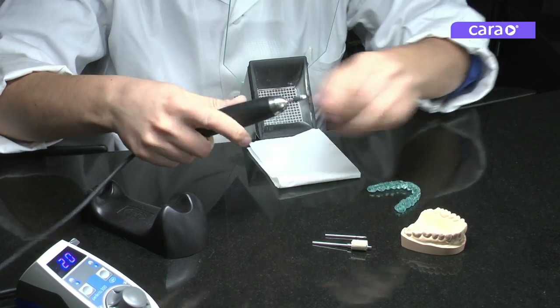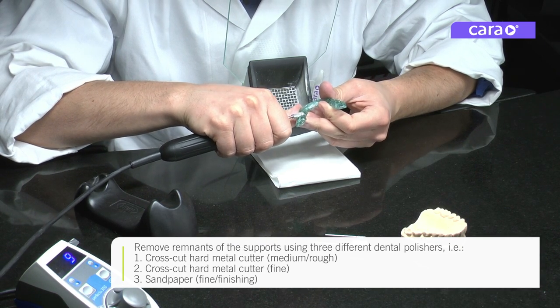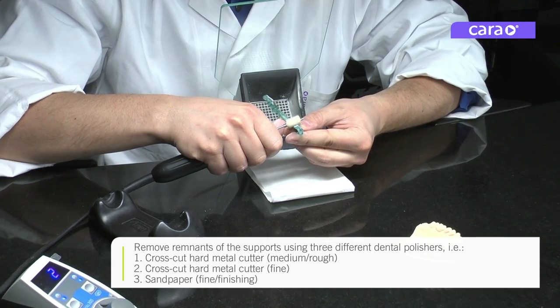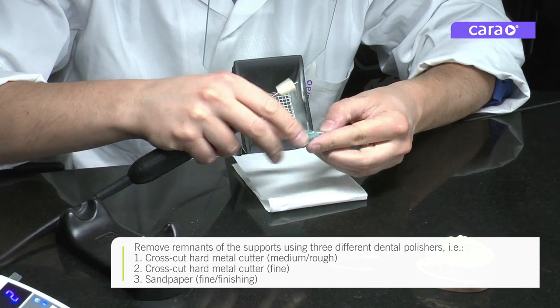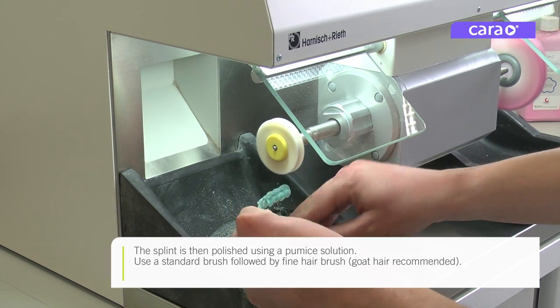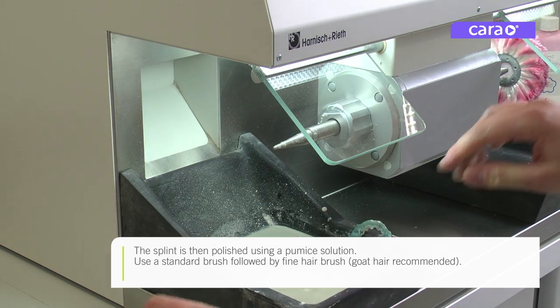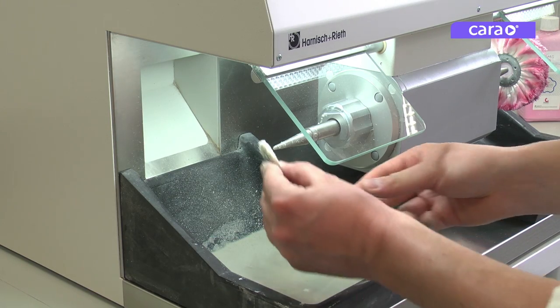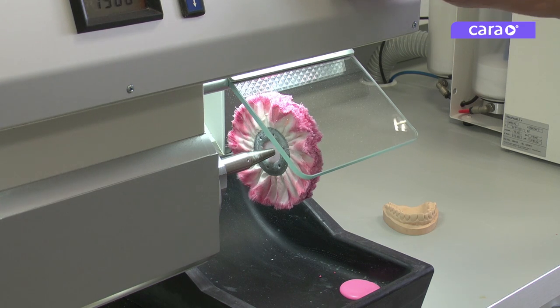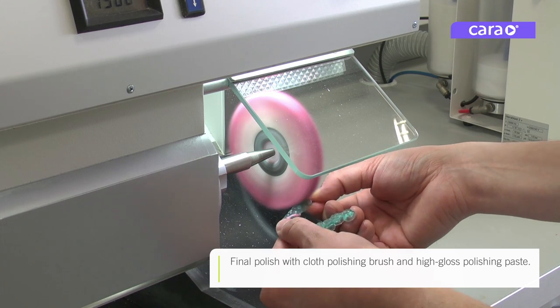Remove the final remnants of the supports using three different dental polishers, such as those shown on screen. The splint is then polished using a pumice solution — first a fleece polisher is used, followed by a fine goat hair brush. Finally, polish the splint using a cloth polishing brush and high-gloss polishing paste.